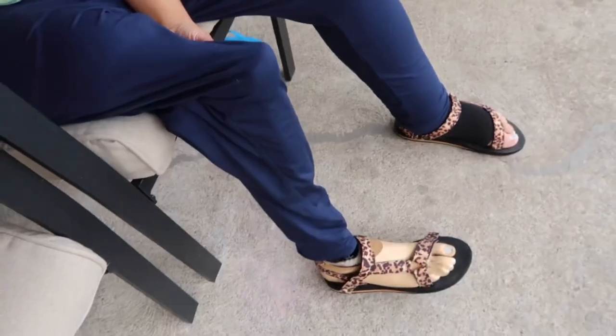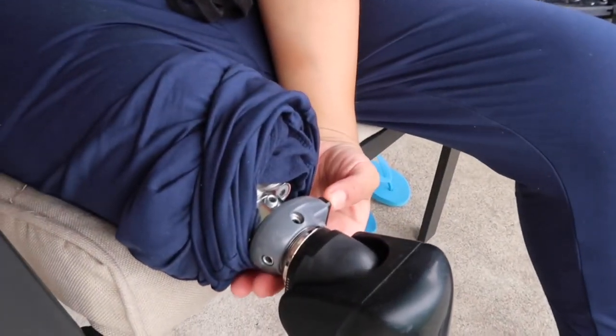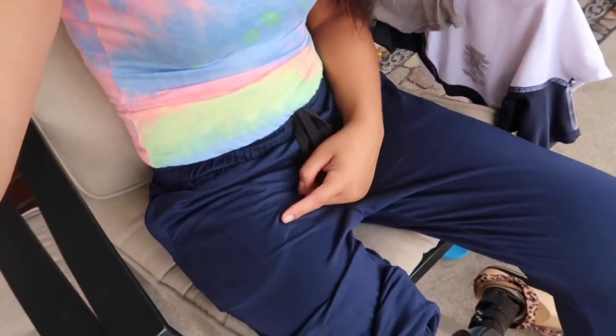Like this. I'll rotate it. Let me show you how I did it. So I pressed the button, hold up, sorry, my leg is like, all right. So I press this button, I press it, and then I can rotate it. So I rotate it when I'm sitting down sometimes because it makes the socket more comfortable. I'll just be sitting down like that, like regular, and I'll just rotate it.